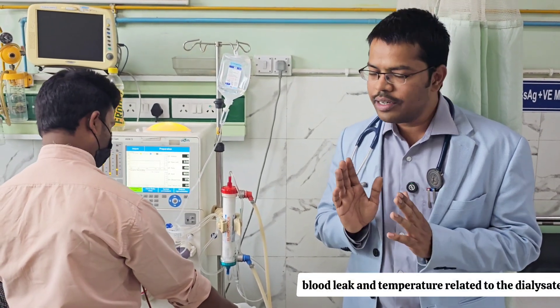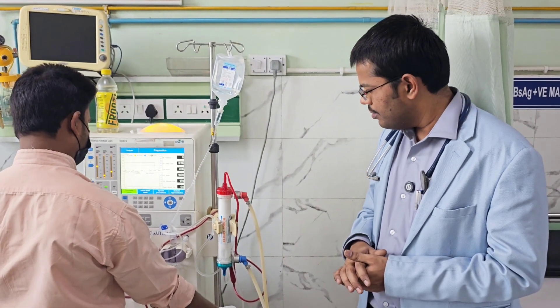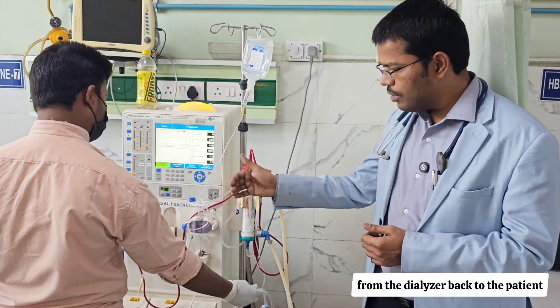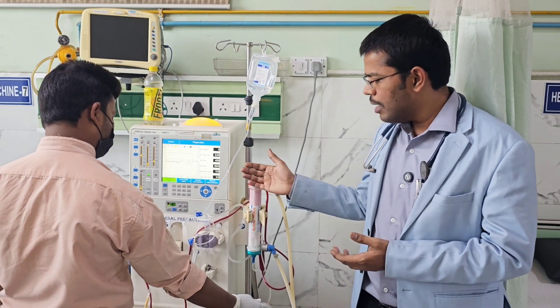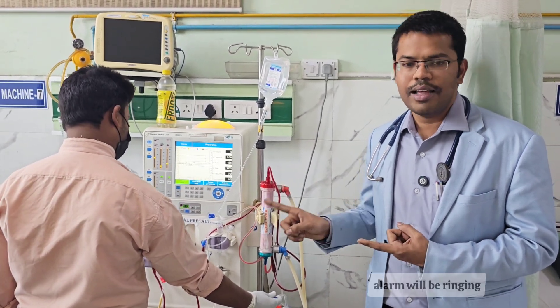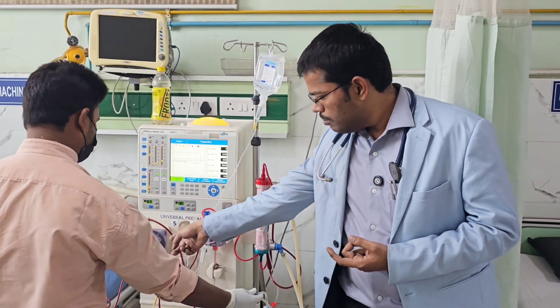Now coming to the blood circuit alarms. The blood circuit goes from the patient to the pump, from the pump to the dialyser, and from the dialyser back to the patient. In that circuit, the heparin pump and blood pump are also included. Whenever the heparin pump is empty or not functioning, an alarm will ring — this is the heparin pump alarm.